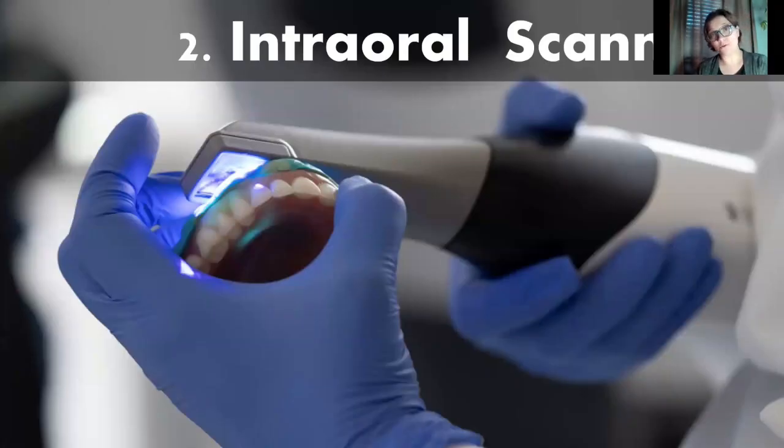If you have an intraoral scanner, like many of us do now, you can utilize that as well. Most of the big scanner companies have now created a module within their user interface that you can use for removable workflows. Most of them will ask you, are you scanning an impression? Are you scanning a denture? You just tell it what you're scanning and you go to town. Hit the button and scan everything.